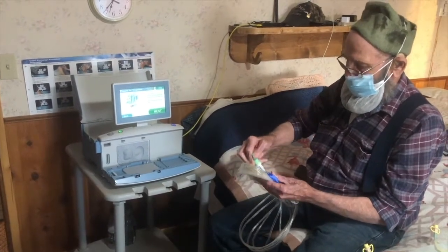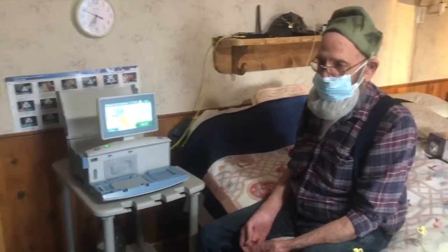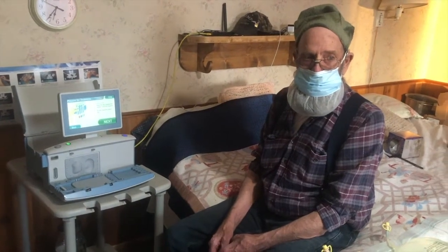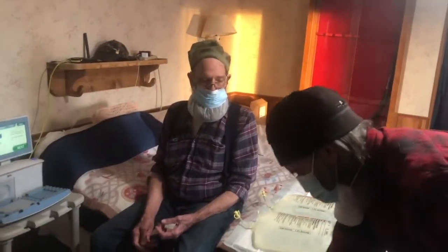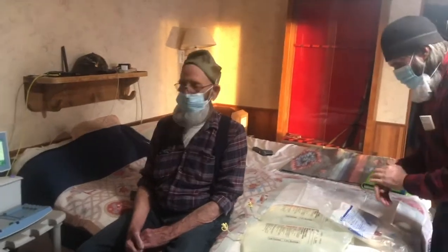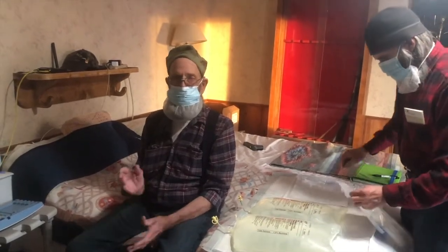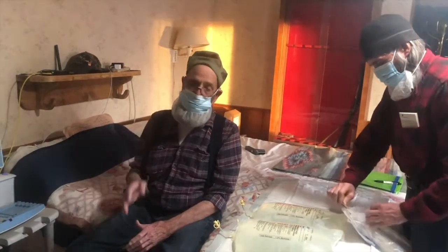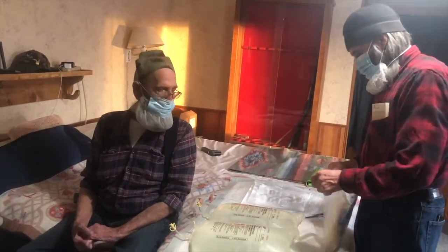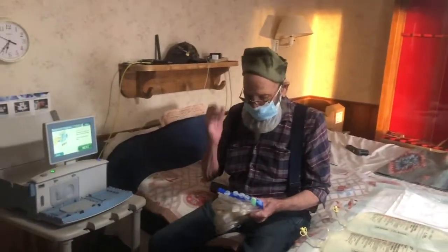Bummer. You want to get another cassette. Yeah, anytime any piece of this touches the floor, or you lose control of it, it ain't worth it. If you get an infection in there, they're going to have to go in there and take that tube out and redo everything again, and it ain't worth it. Sometimes you'll get one that won't work at all. The machine won't accept it no how. So you don't mess with it. You just throw it in the trash and get another one, because they send you plenty of them. The main thing is you don't want to take any chance on anything happening to you.